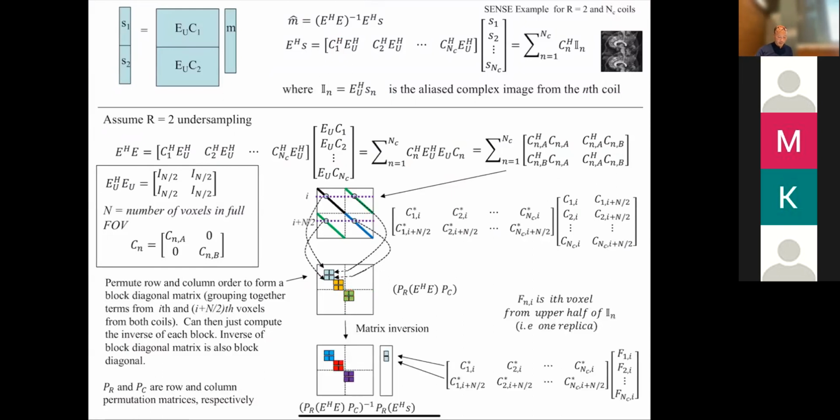Okay. So that's basically what the SENSE algorithm is doing, is taking this matrix, and this is quite common in especially EE signal processing. You have a matrix that is really hard to solve if you solve it without noticing the structure, but if you rearrange it, all of a sudden you can break it into lots of smaller problems. So a lot of stuff that we depend on every day in our phones and our computers is just really smart people going, this is going to take forever to solve in its native form. But if I rearrange it, I can break it into smaller problems, which are cheaper to solve.